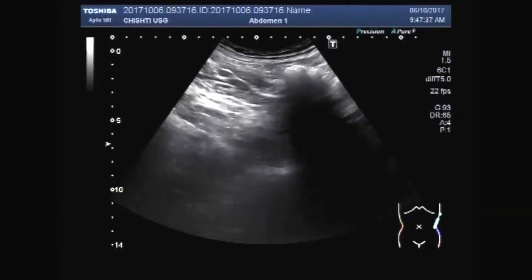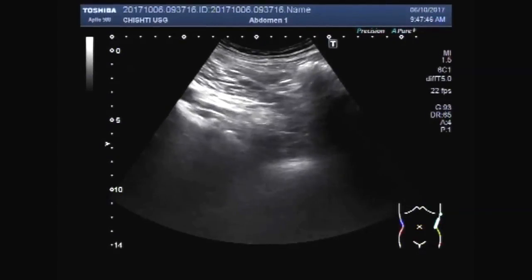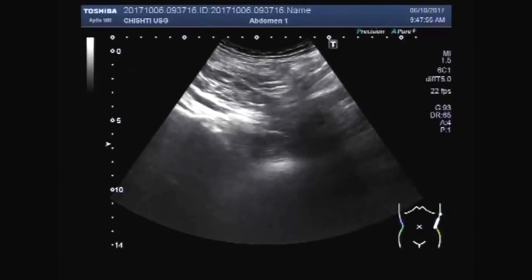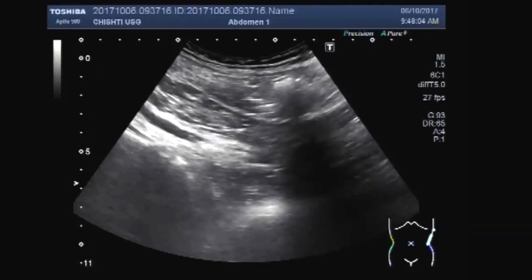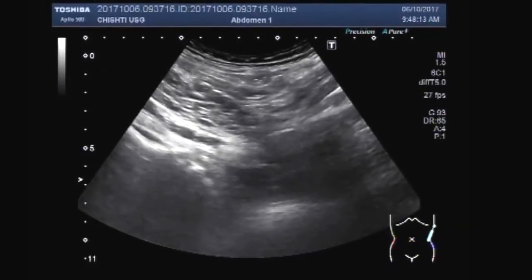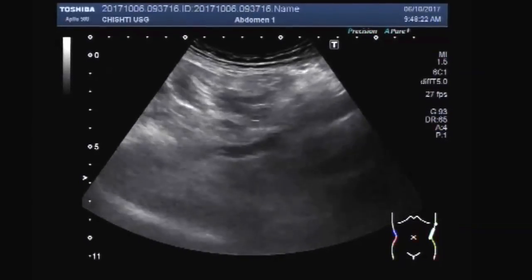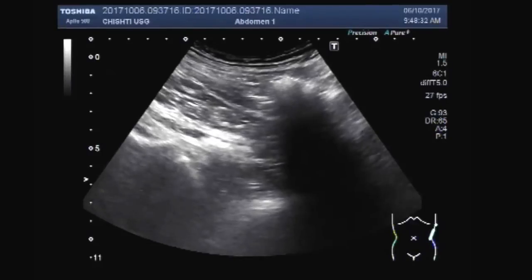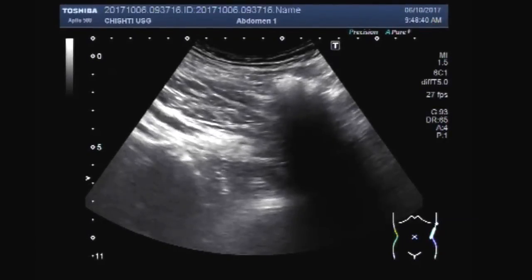The ureter is just crossing the iliac vessels and multiple stones and sludge are seen. You can see the to-and-fro movements of the sludge inside the ureter — this is the characteristic movement of sludge within the dilated ureter.